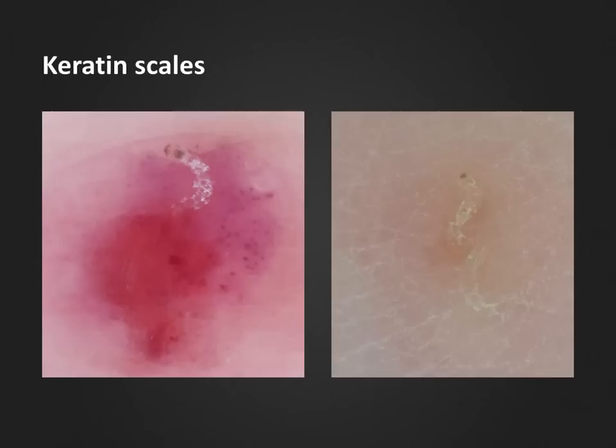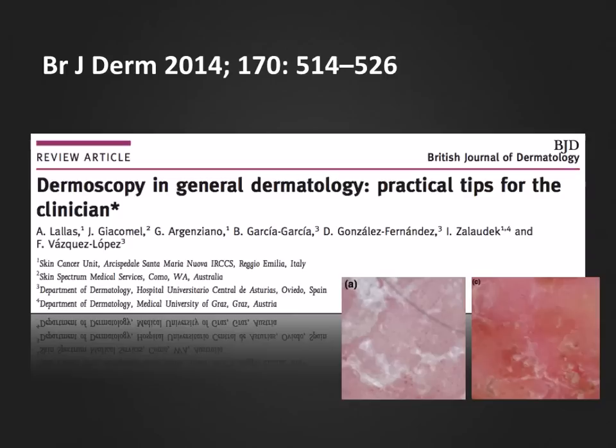Another example of scales are these two cases of scabies, in which a white trail of keratin scales are found in the wake of the scabies mite digging its typical burrow in the epidermis. The typical grey boomerang-shaped head can be seen at the upper tip in both cases.